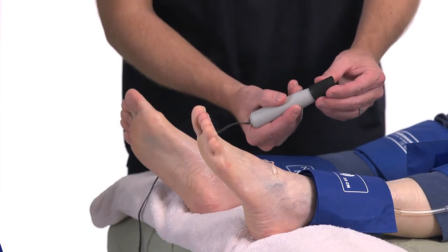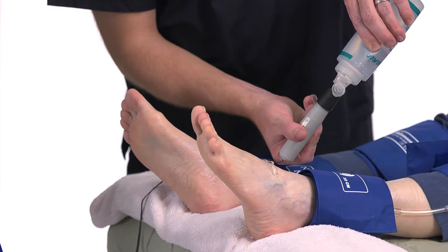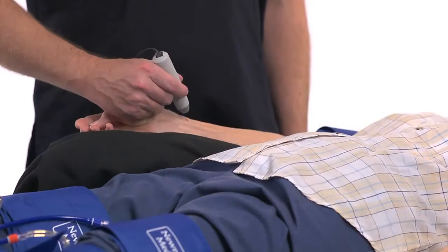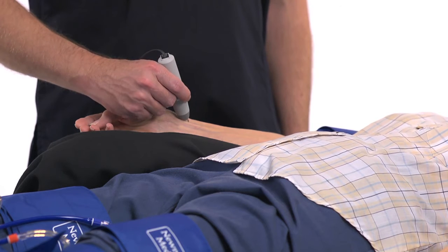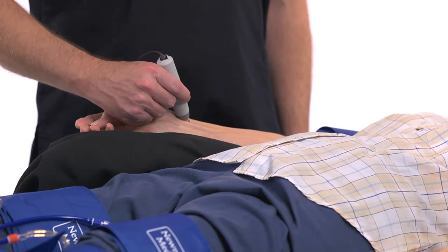The Newman Medical Angled Standoff, or cheater, can help with holding the probe at the correct angle and keeping it in place. The cheater also helps to keep from pressing so hard with the probe that the artery is occluded. When taking the arm pressure, the radial artery is usually preferred because it is easier to find. However, the brachial artery may also be used. Lightly palpate the artery and place the Doppler probe where a pulse is felt.